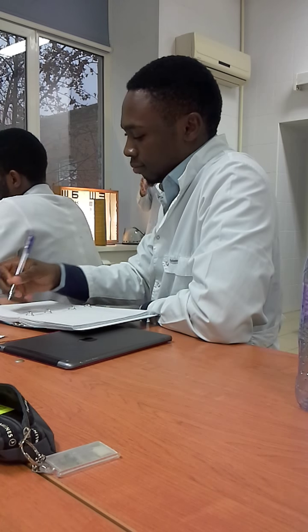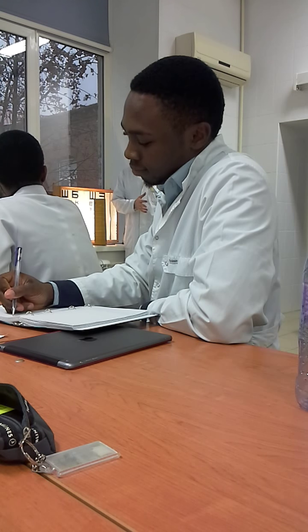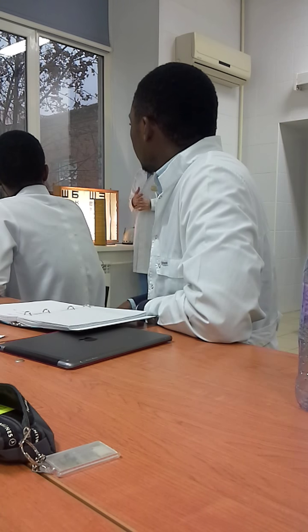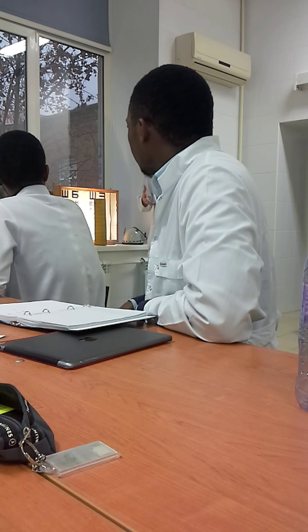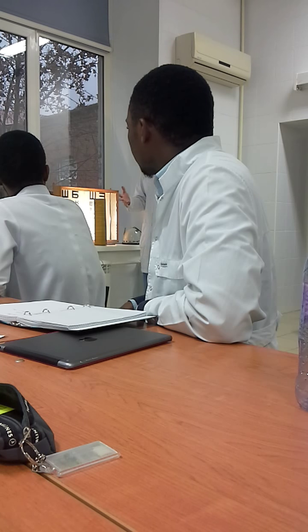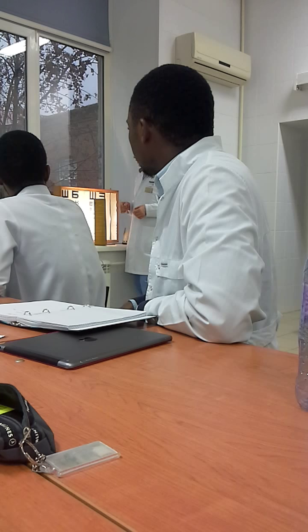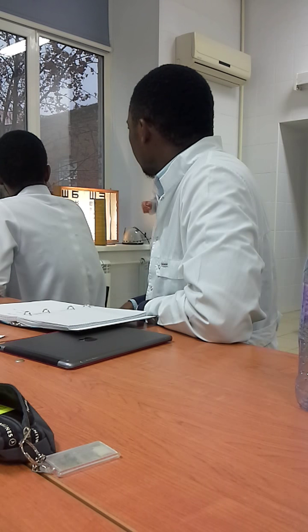Because for us, it is necessary to know whether vision is normal or less than normal. If normal, it is not necessary to examine the patient further. If less than normal, it is necessary to determine why — refraction disorders, other disorders of the eye, and so on. The distance for examination is 5 meters.